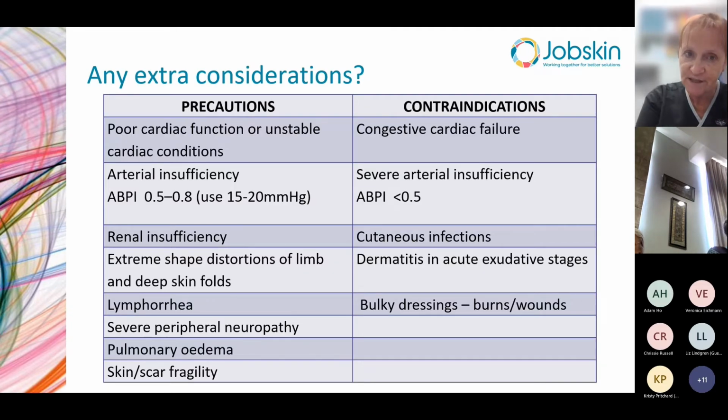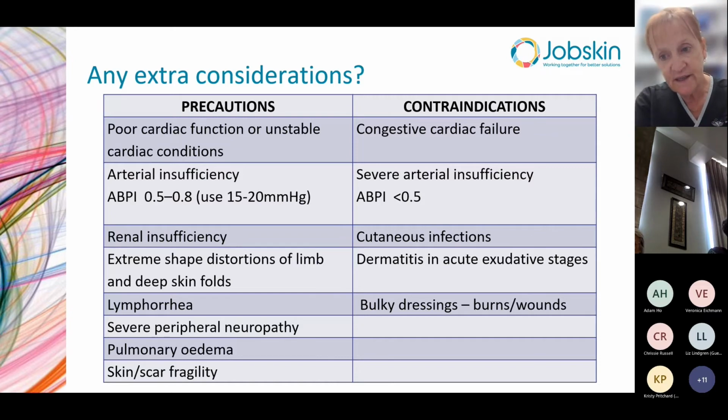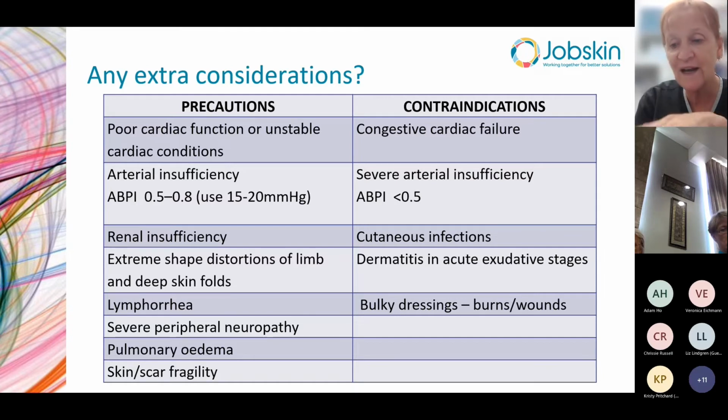Now, what do we need to consider when we are prescribing a garment? As a very basic screen, we need to consider whether someone is fit for compression. One thing that Veronica and I would both say we observe is that, particularly working in the areas of scar management, where we have a very clear focus of the benefit and the need for compression, sometimes some of these other functions or precautions can be overlooked. So it's important, regardless of the reason for compression, that we do a basic screen for fitness for compression.